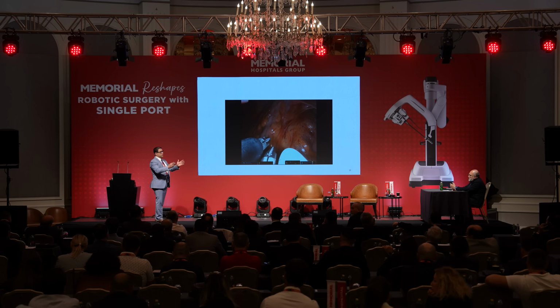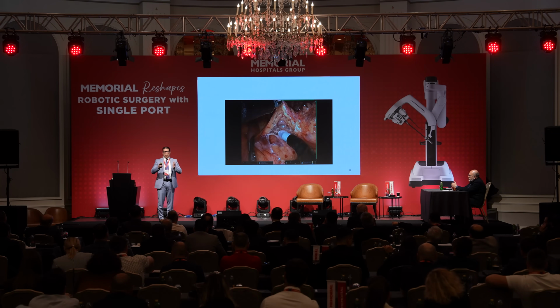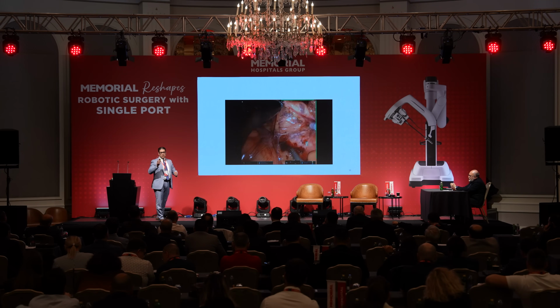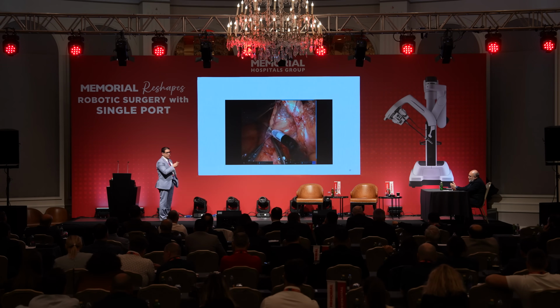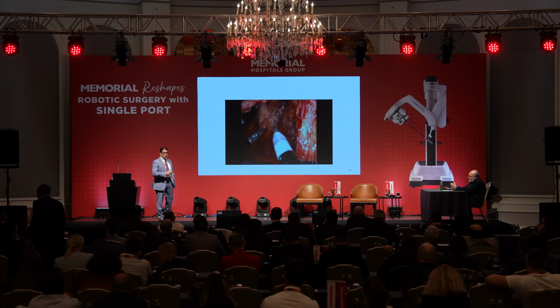Again, it moves in unity. You have to retract your arm in, and then you have to move like the right side or left side. I'm going to show you everything how it happens with the SP. I'm doing here sub-IMV dissection to mobilize the splenic flexure because I extract transanally. So I need the splenic flexure to be fully mobilized.